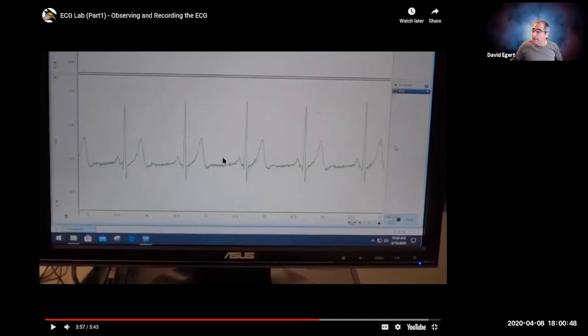And at this point, it's being generated primarily by the depolarization of the cardiac muscle, which is big enough that it shows up as a signal that you're measuring on these electrodes taped onto your wrists. So it's important right now to really think about what you're actually looking at. You're looking at the electrical voltage measured on your skin, but that's ultimately being generated by your heart.